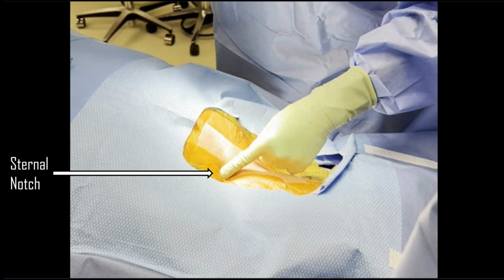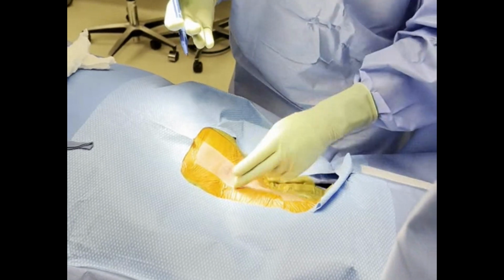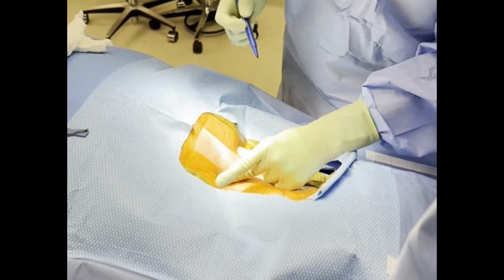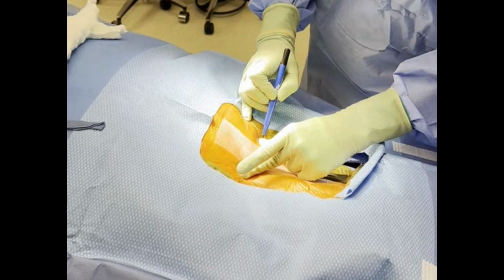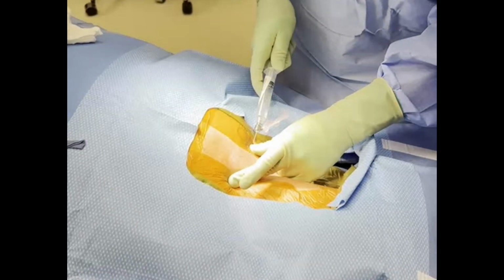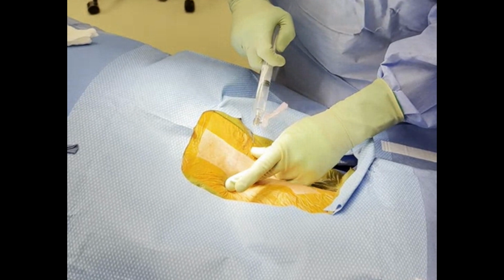You're going to want to find the sternal notch and the acromioclavicular joint, and then measure 1/3 of the way from the notch to that joint along the clavicle. It's going to be right around the bend in the clavicle. Measure 1 centimeter lateral to that and mark it. Once it's marked, inject local anesthetic to create a wheal, and then inject local anesthetic in the subcutaneous layer and around the clavicle as well.